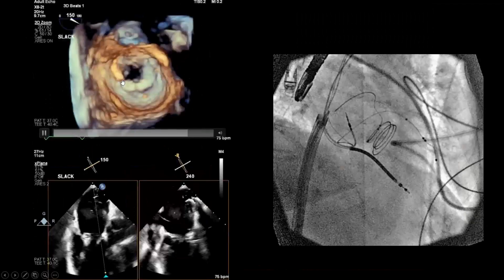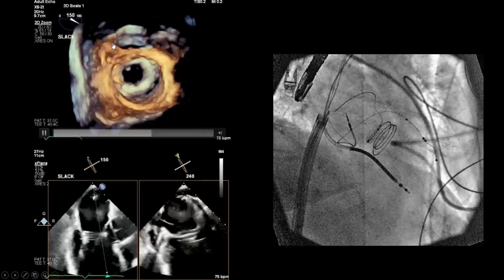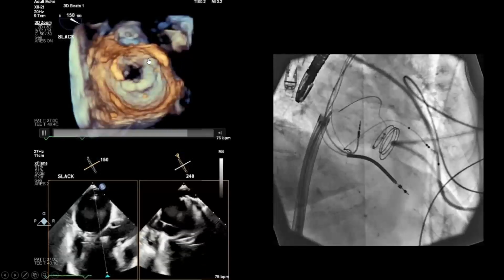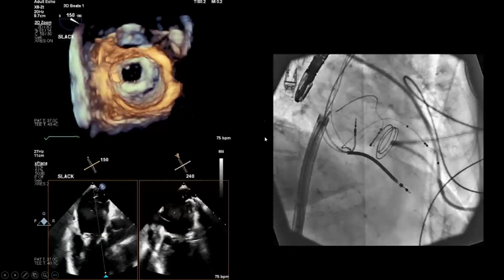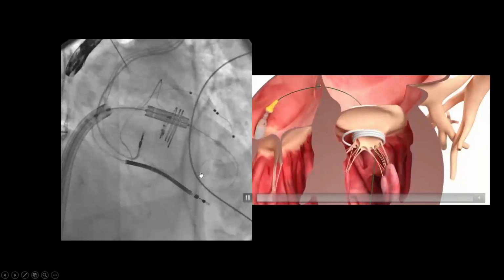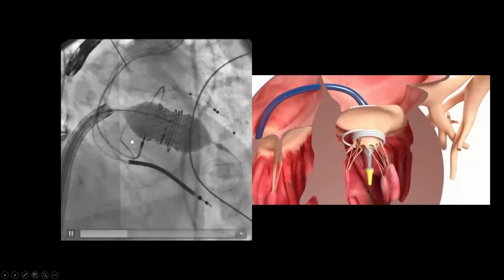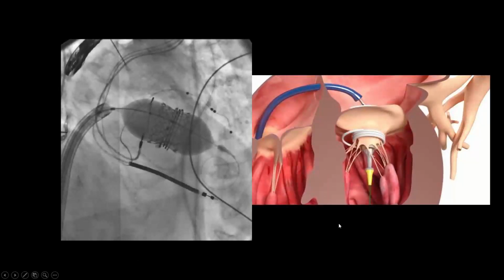And then the final stage is to deploy the atrial part, and you can see here this is the mitral valve, this is the aortic valve, this is the left atrium, and you can see the PVL guard, the balloon-like structure over here, and the arm of the docking system over there. So the docking system was deployed, then we advance the valve through the docking system, and it becomes a valve and ring procedure. The valve is inflated into position with a balloon.